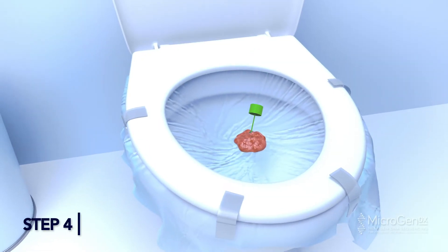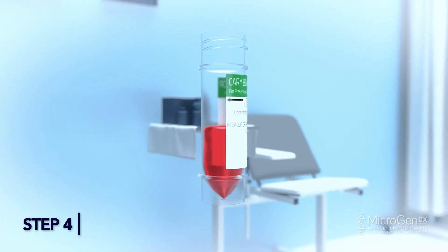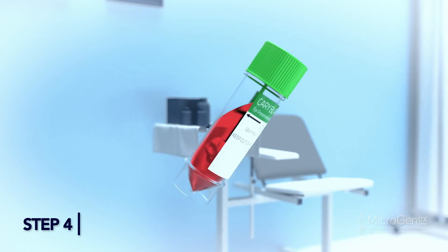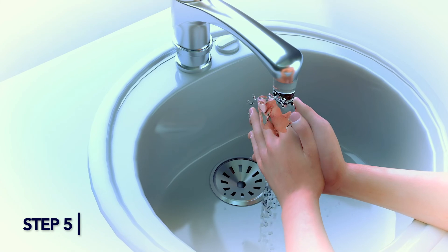Step 4: Using the spoon-like scoop, add fecal matter into the container until the liquid reaches the arrow mark on the label, and screw the lid on tightly. Shake the tube vigorously to mix the sample with the liquid. Step 5: Wash hands thoroughly.